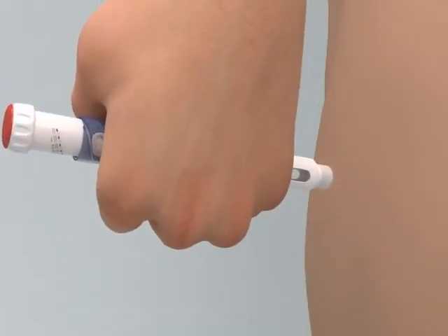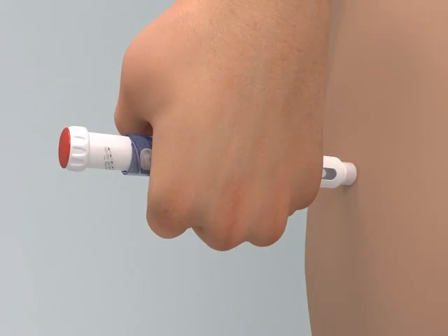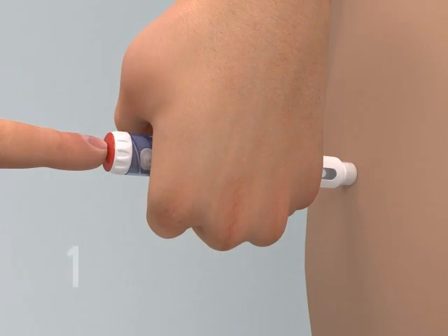After inserting the pen needle, push the injection button in as far as it will go and press firmly. You'll hear a clicking sound as your dose is being injected. Continue to press firmly for five seconds before removing the needle from your skin. Stop pressing before you carefully remove the pen needle from the skin.